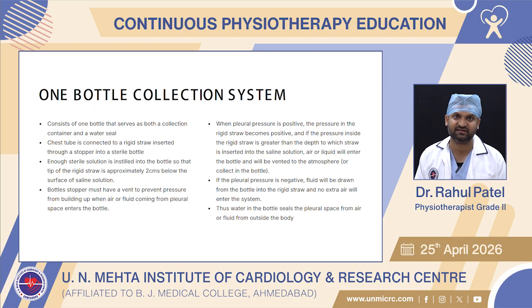The chest tube is connected to a rigid straw inserted through a stopper into a sterile bottle. Enough sterile solution is instilled into the bottle so that the tip of the rigid straw is approximately 2 cm below the surface of the saline solution. The bottle stopper must have a vent to prevent pressure from building up when air or fluid coming from the pleural space enters the bottle.